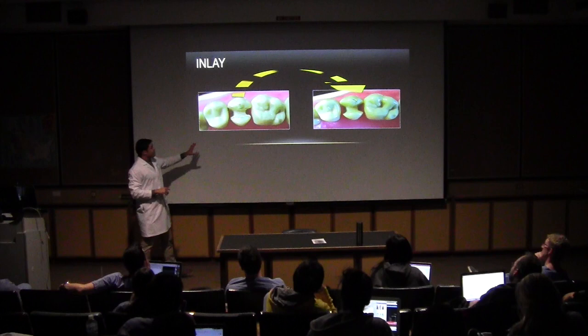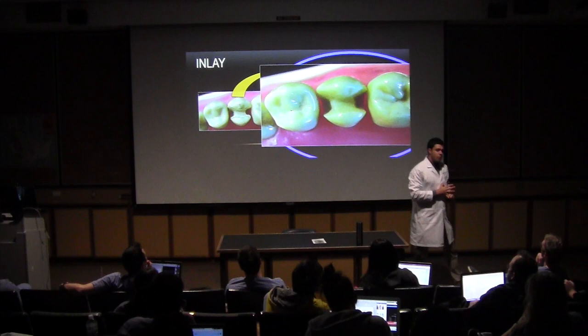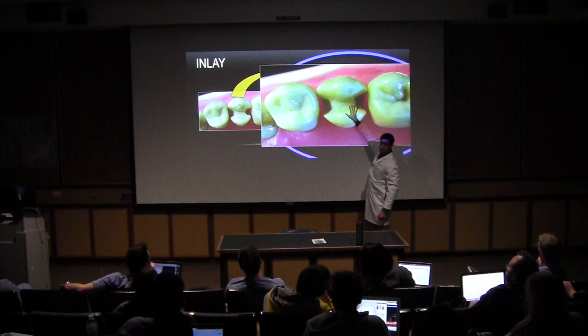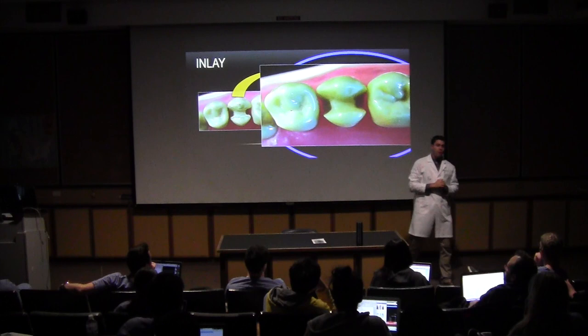So here we have before and after we work on the margins of the proximal box and on the axiopulpal angles. Remember, the clearance at least 1 millimeter and the axiopulpal angle is smooth and round. Okay?